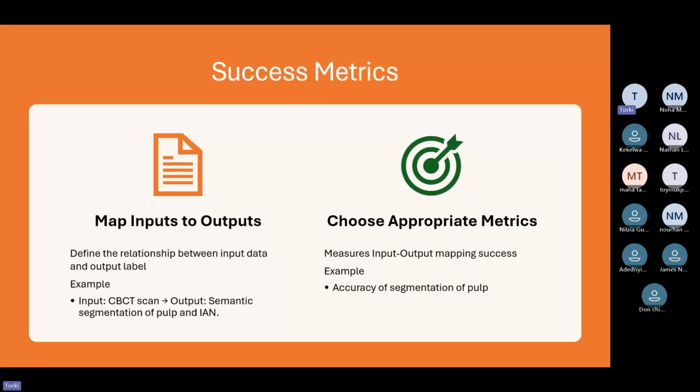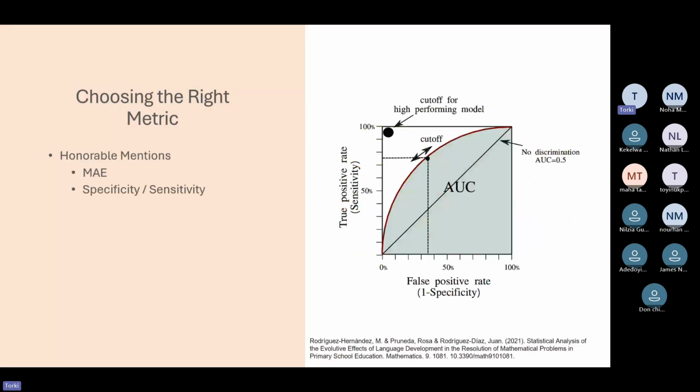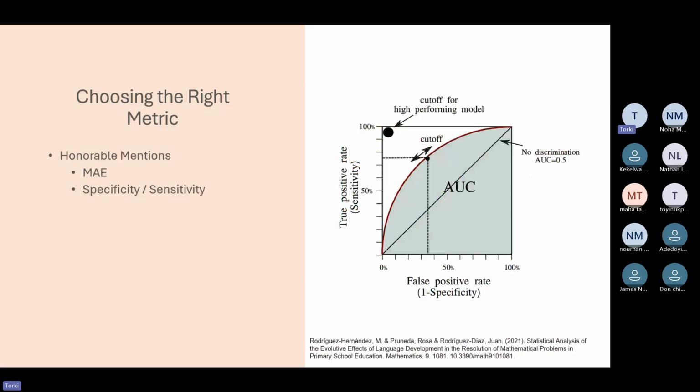One way to understand the quality of your algorithm is to compute this AUC, because it gives you the relation between the false positive rate and the true positive rate, that is, 1 minus specificity and sensitivity. But we don't usually use it in reporting as a main metric. Our main metrics are usually the DICE, IOU, and the Hausdorff distance. Okay.